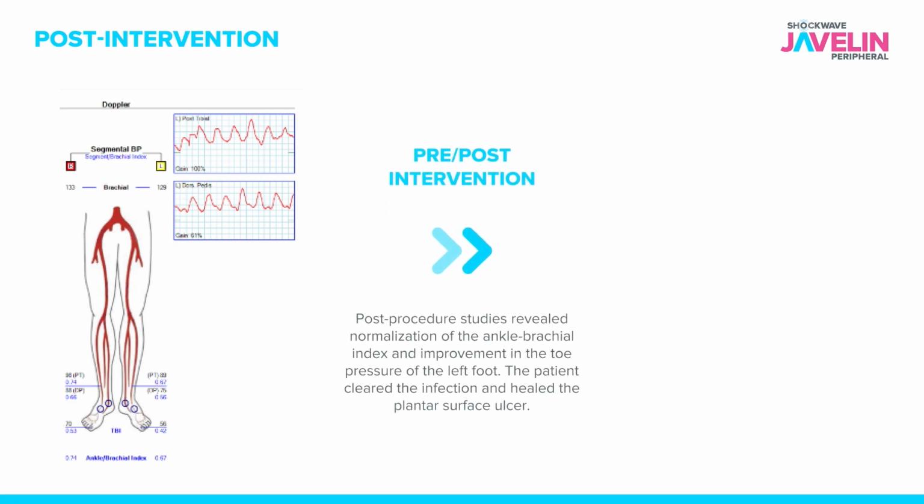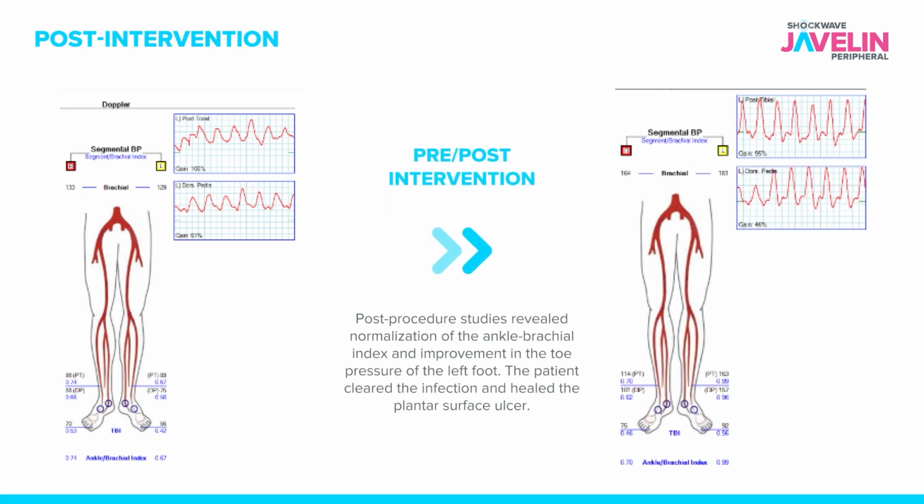Postoperatively, she had significant improvement in her vascular lab studies with normalization of her ankle brachial index and a significant improvement in her toe pressure. But most importantly, she was able to clear the infection and she ultimately healed her plantar surface ulcer. So a very nice radiographic and clinical result.